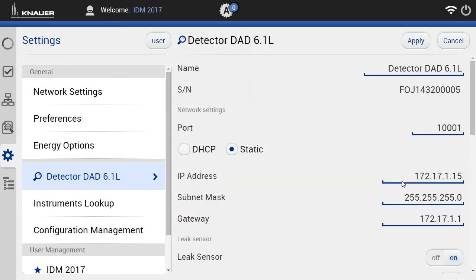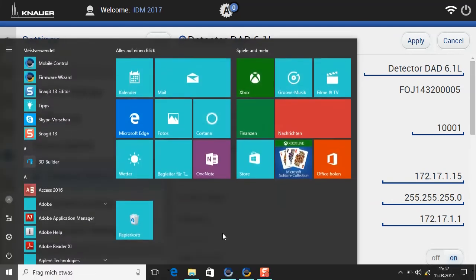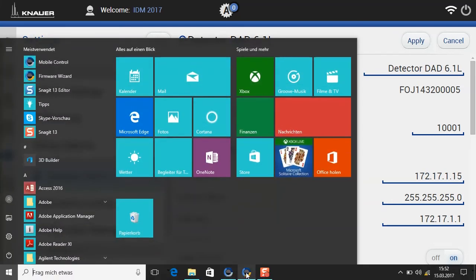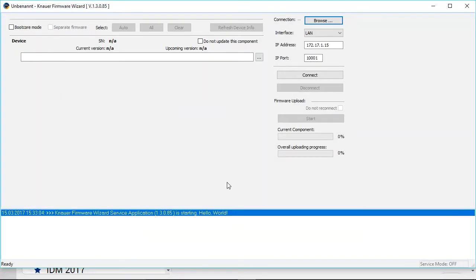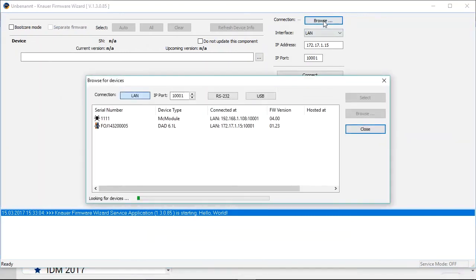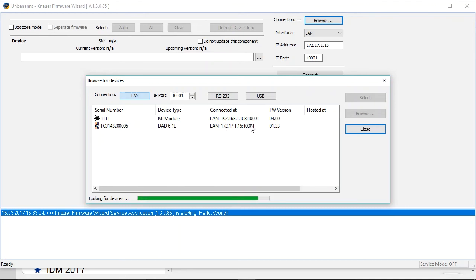We can also check this, for example with the firmware wizard. So we will just change to the firmware wizard software. And here we can browse the network, and as you see it finds the detector with the IP number I just typed in.